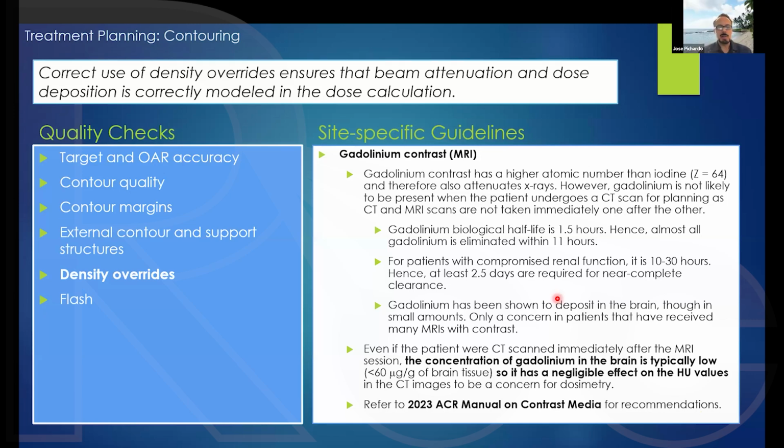Yeah, I know what you're talking about, the part that has the infrared balls. That is actually designed to have a very, very low X-ray signature. Now, what I have done, just because I want to play it safe, is I include it, because it doesn't really affect anything. We actually put it on when we're simulating the patient, that way the CT image also has the attachment with the infrared spheres. I think it's too small of an effect.